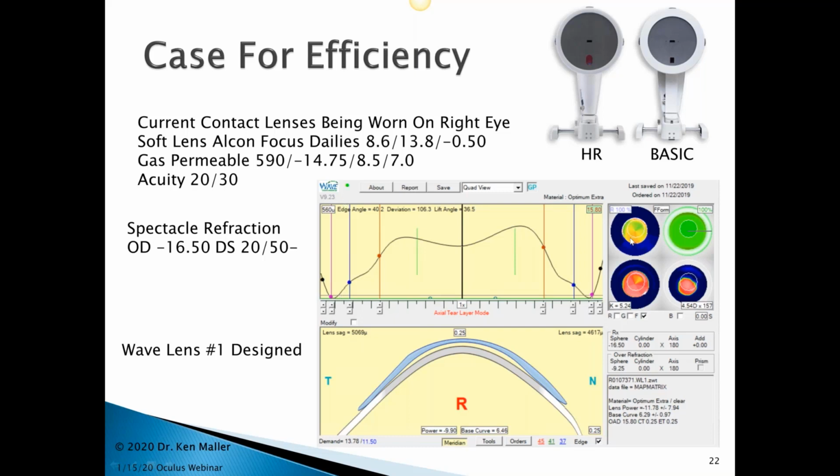This here is the Wave software design screen. And I'm not going to go into Wave here, but what you need to take away from this particular screen, for those of you who don't utilize Wave or are unfamiliar with Wave, is that in the bottom half of this screen, as soon as I get my cursor here, you can see this surface, which is gray, and then it's white out over here.